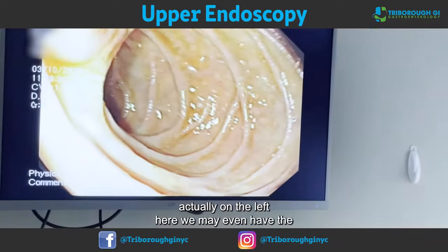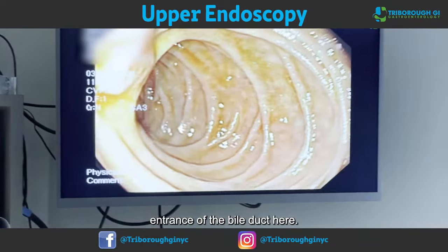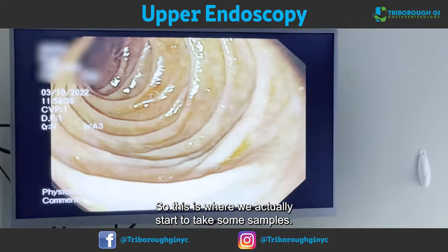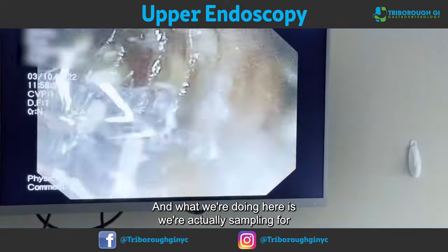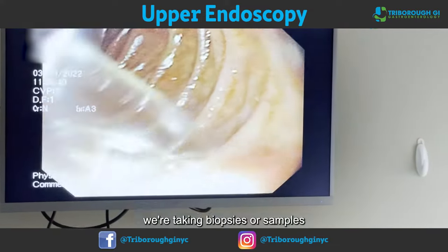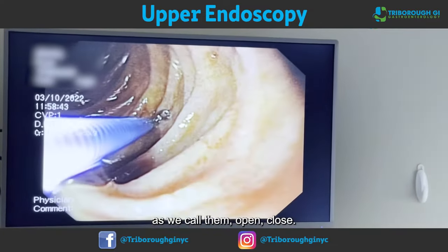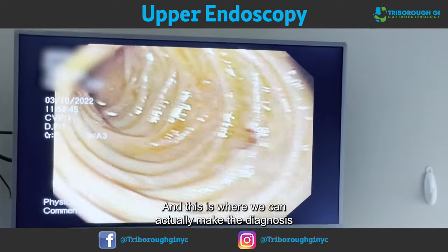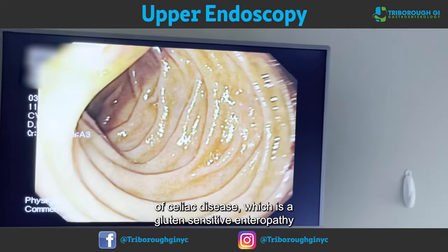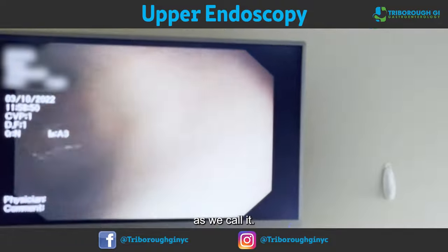On the left here, we may even have the entrance of the bile duct. So this is where we actually start to take some samples — biopsies, as we call them — open, closed. This is where we can actually make the diagnosis of celiac disease, which is a gluten-sensitive enteropathy.